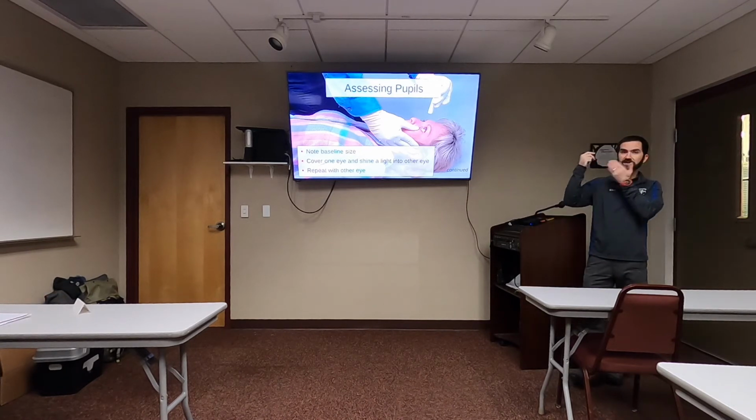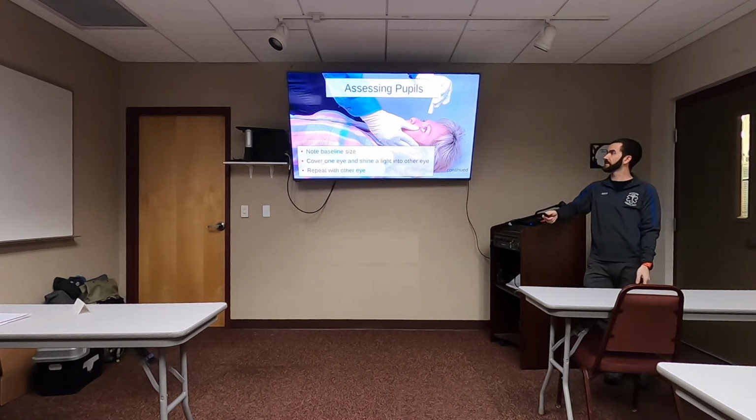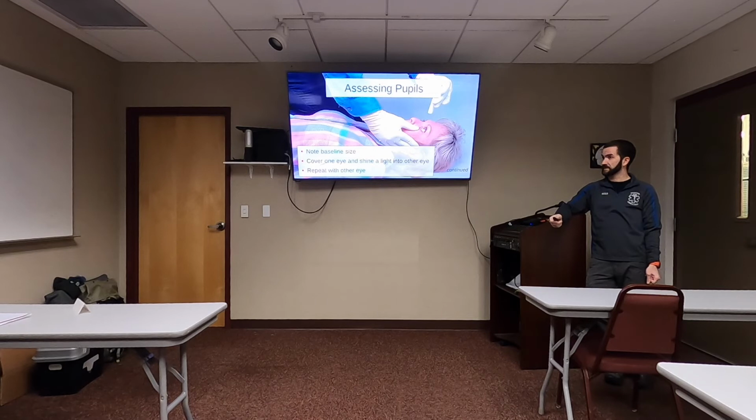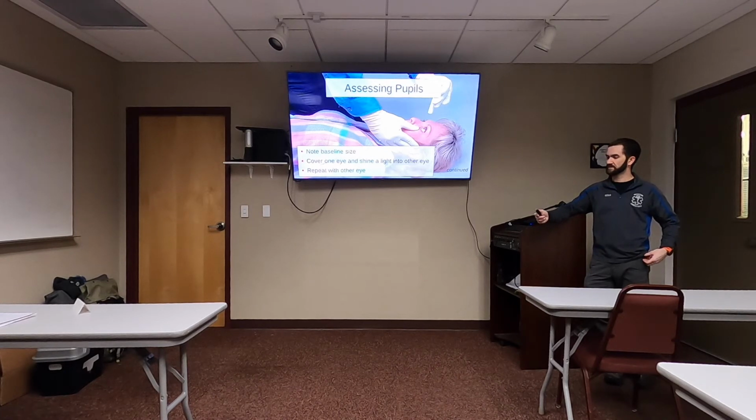Test for reactivity one eye at a time with a little pen light. Try and use the little pen lights that are designed for this task and not some mega spotlight flashlight thing. Flashlights have gotten increasingly powerful over the years, and it's pretty easy to carry a super bright little light in your pocket, so go easy on poor patients.